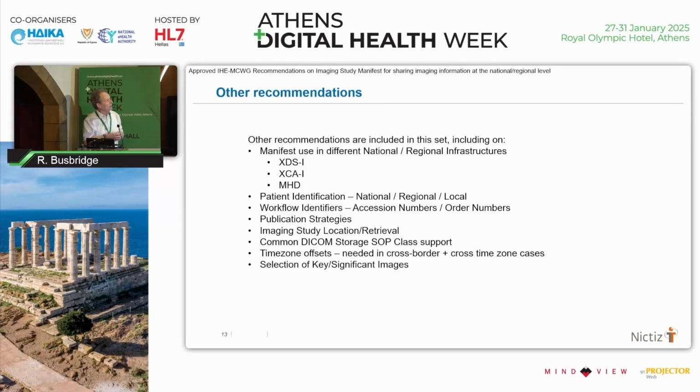Charles mentioned the links between reports and studies, underlying studies. So these are sort of workflow identifiers. Obviously, if you do a request and you retrieve, you get back some reports and manifests, you've got to be able to link those together. They won't be automatically linked together. They'll come back as separate query items, and it's up to you then to look at the accession numbers, order numbers, etc., to build the relationship between the items that you've retrieved.